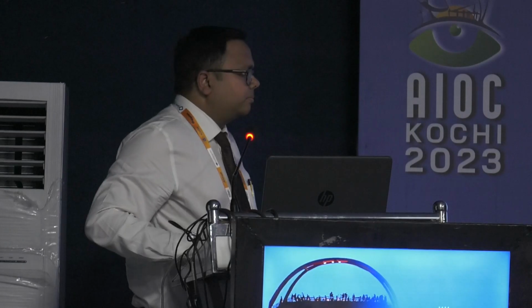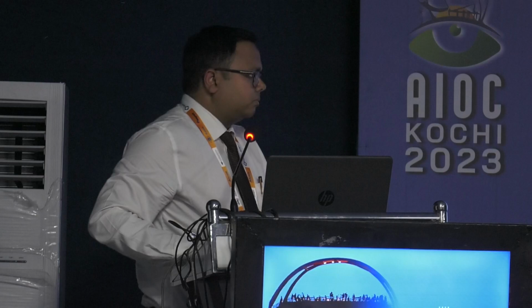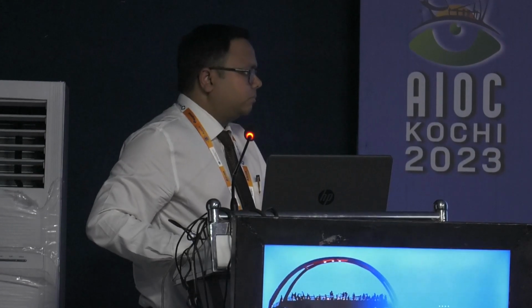And it's important to realize that you have to have a sufficient amount of haptic to tuck in. Only in pediatric cases can you cut off some part of the haptic, in case you feel it's a very long haptic. Otherwise, in most cases, with the Gabor's carrier technique or whatever technique you are following, you can tuck in the IOL and tuck in the haptics. And the important part is the tip of the haptics should not be exposed.